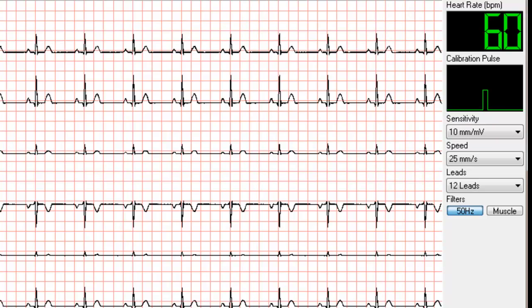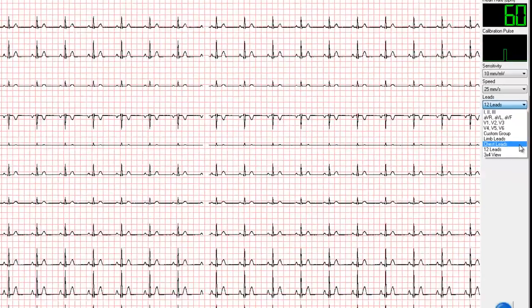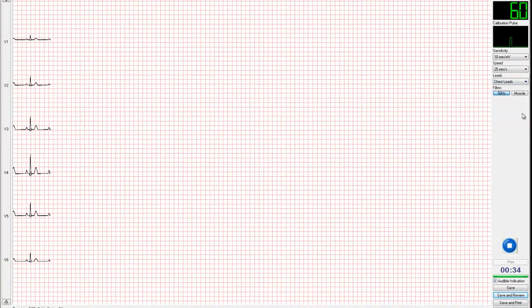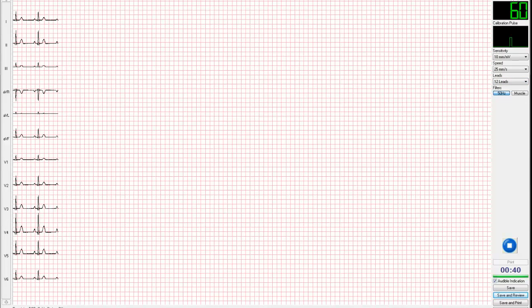The lead display menu provides you with the option to view a variety of different lead views. For example, you can isolate the chest leads. We would recommend that a 12-lead view is used, so that you can see that a good quality trace is being received on all leads.